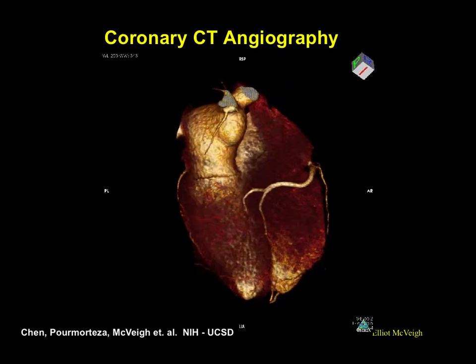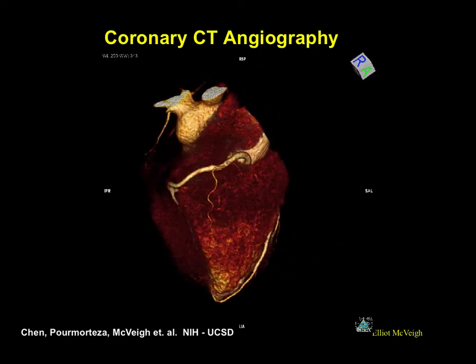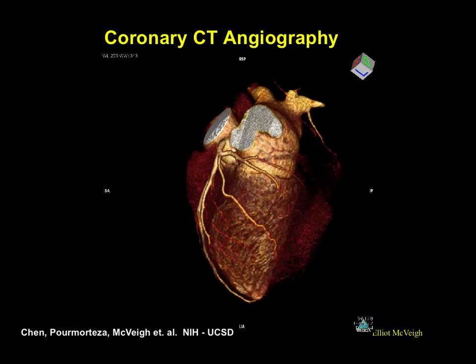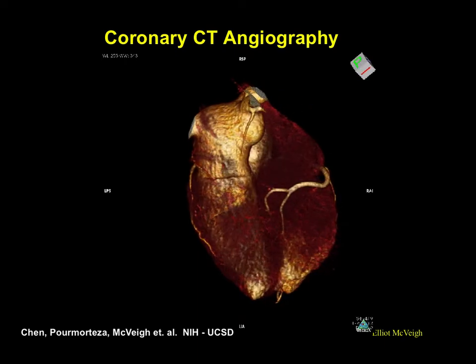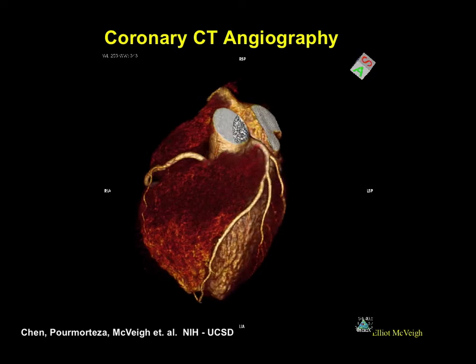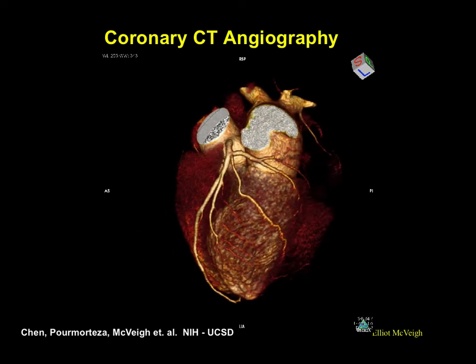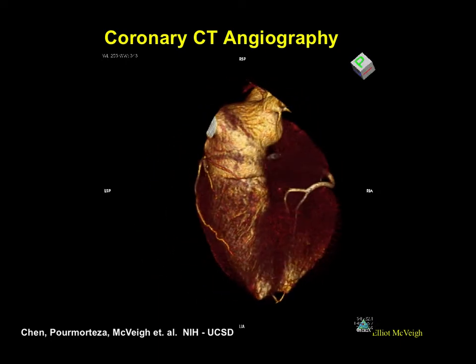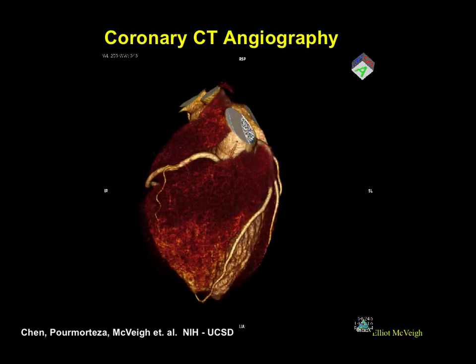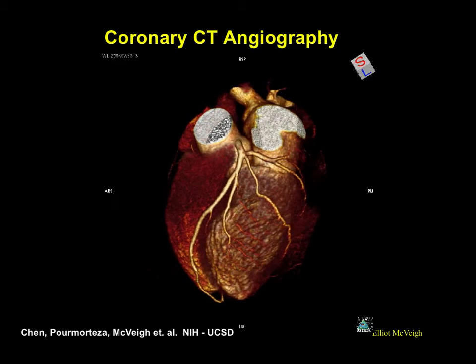The resolution will be somewhat bigger than that. If we look at the point spread function and ask, what's the spatial width of that point spread function, it should be bigger than the smallest voxel you're willing to use to create a picture, right? And so the point spread functions are around a millimeter, somewhere in that range for these scanners.